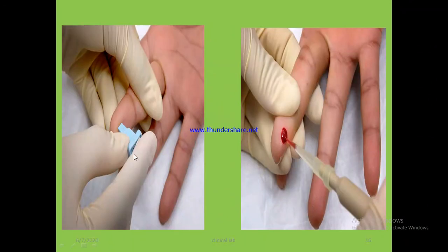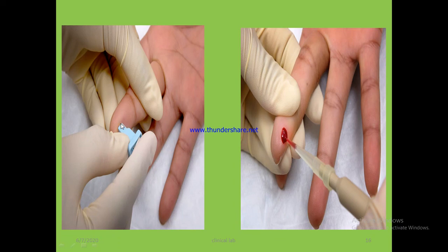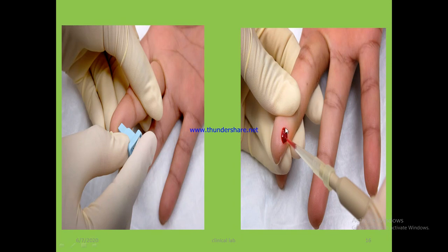Here is the procedure: after the skin is cleaned with an alcohol swab, puncture not the tip but the side of the finger, using an automatic or other type of lancet, positioning the hand palm up. After puncturing, remove the first drop and collect the blood sample using the appropriate materials.